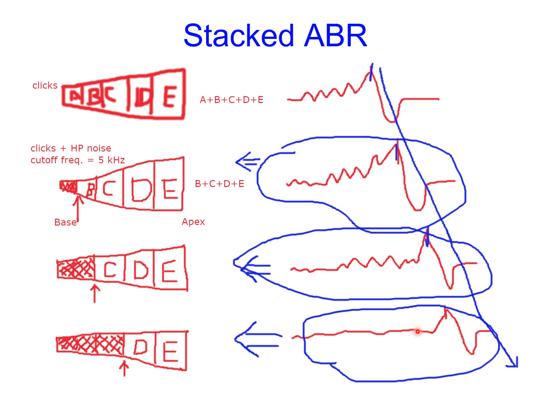And for this stacked ABR waveform, you will have a very, very big wave five amplitude. And that stacked ABR will come from all different regions of the cochlea, not just the high frequency portion, but also the low frequency portion, because it's an addition of all different recording conditions, and that includes the high frequency, the basal end, and also the low frequency on the apical end.